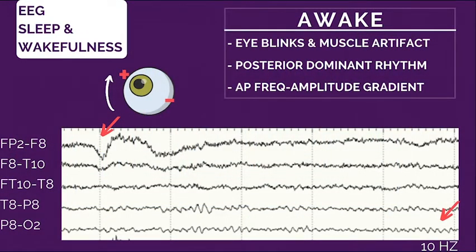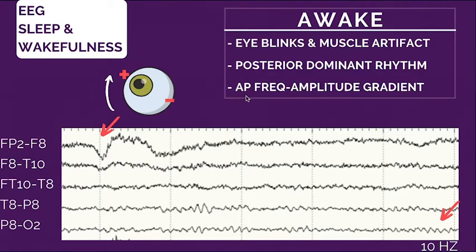How can we tell somebody's awake looking at the EEG alone? There are a few key things. If we see eye blinks, obviously somebody is awake. If there's muscle artifact, they're likely moving around and contracting muscles, so they're awake. We also have the posterior dominant rhythm, which indicates awake but relaxed, and the anterior-posterior gradient, also common to the awake state.